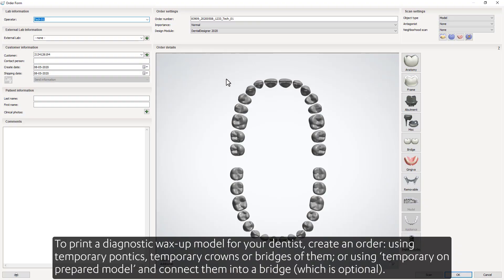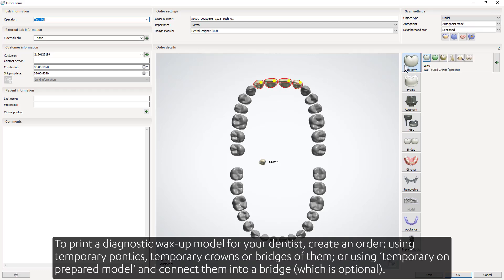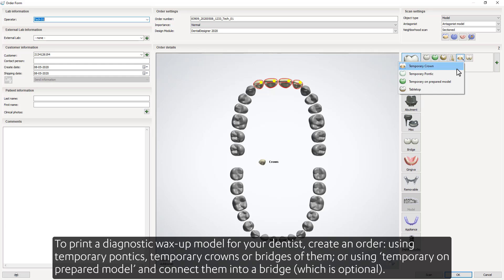To print a diagnostic wax-up model for your dentist, create an order using temporary pontics, temporary crowns, or bridges of them. Or use temporary on prepared model and connect them into a bridge, which is optional.